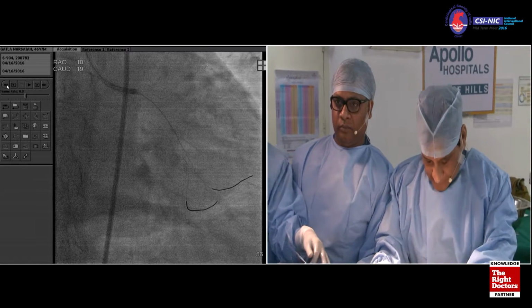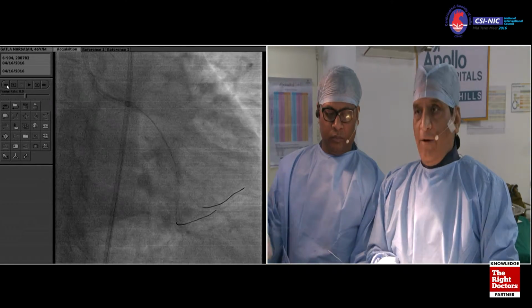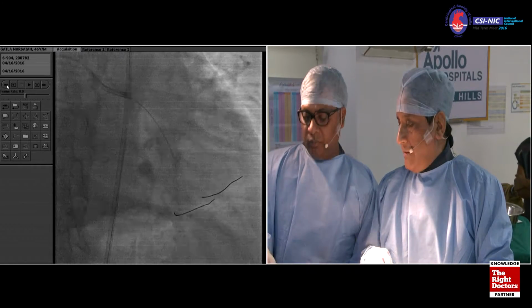We are sorry to inform you that we just have 5 minutes with you. Might be switching over to the other cath lab. Okay, but we want to see it actually. Yep, sure. So we are going with this now.